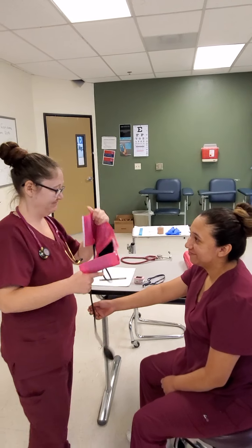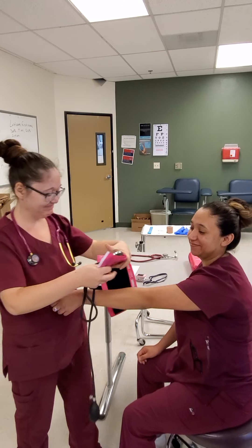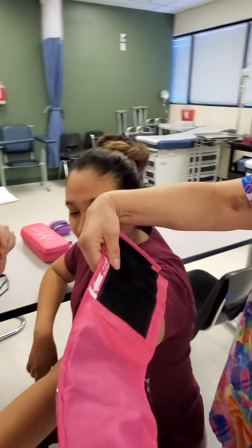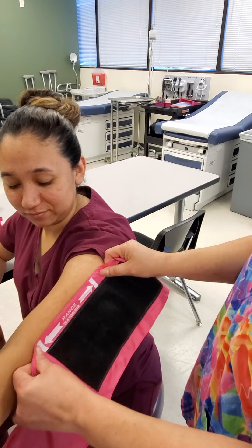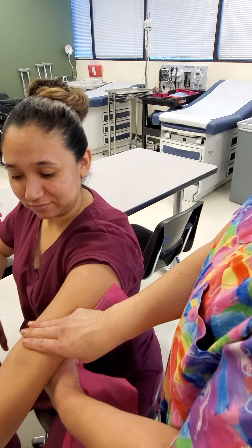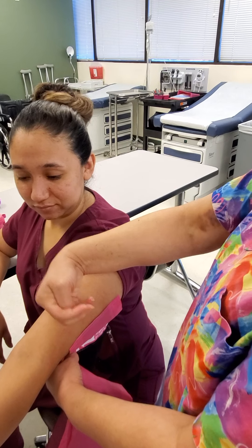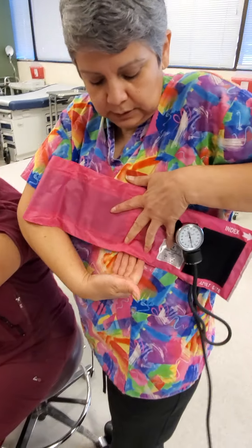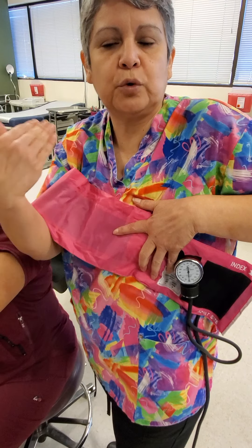She's going to show you how she measures. If you remember, the cuff needs to fit right in that range — two inches above the antecubital fossa site. So we don't tuck the bell of the stethoscope underneath. If we tuck it underneath, you get distorted sounds, and we don't want that. It confuses what you're trying to listen for.